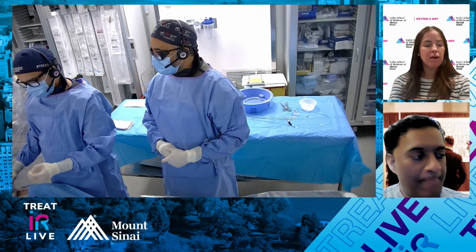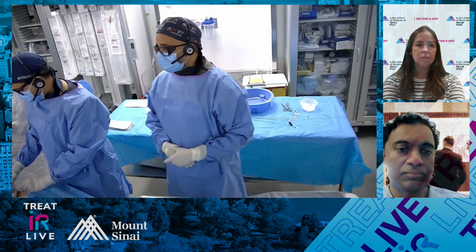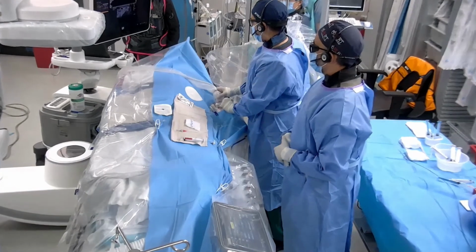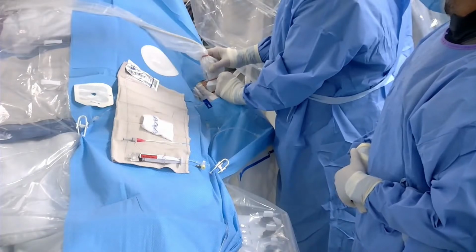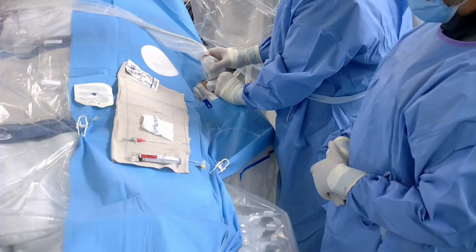Rahul, let's talk a little bit about your choice of access. Ishan right now is getting radial access. We numb, and he's going to use the needle to get in. I don't know if you can see the ultrasound, but he has a nice big radial artery. He's had that right groin accessed a couple of times and will get it accessed one more time to place the limb extension later, so we'll stay out of it for now.